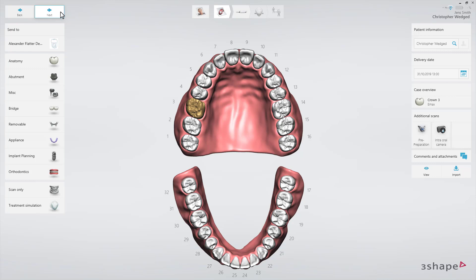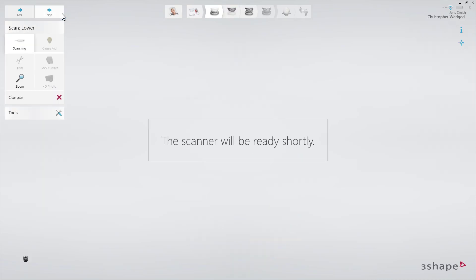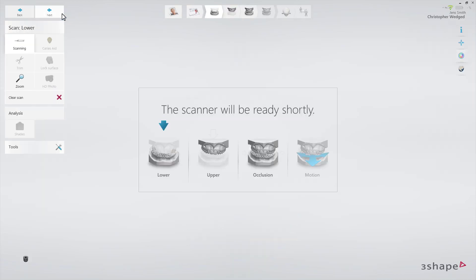Use a retraction cord and/or hemostatic agent if parts of the margin are subgingival. In this case, start by scanning the opposing arch to allow time for the retraction methods to take effect.